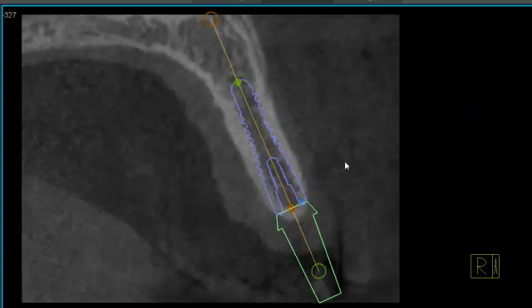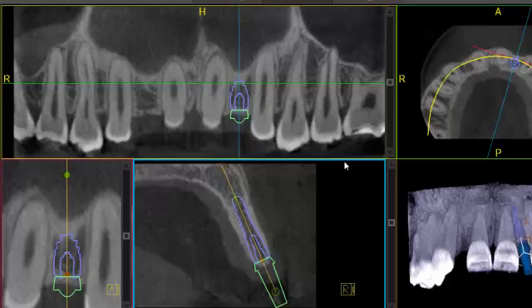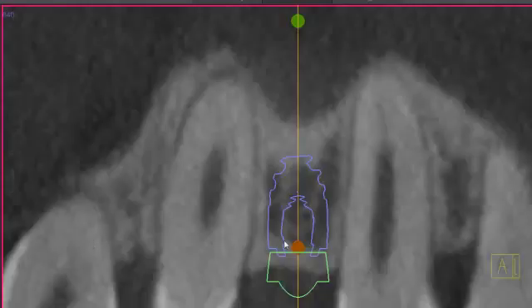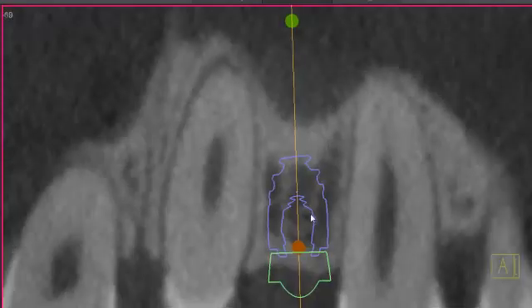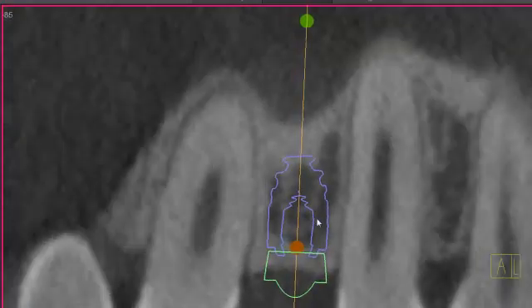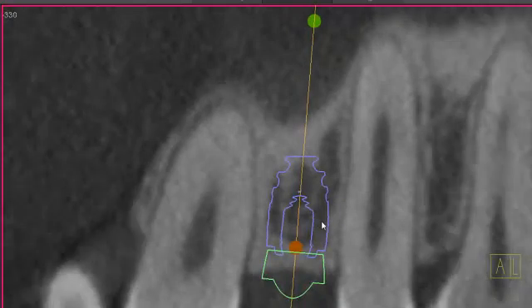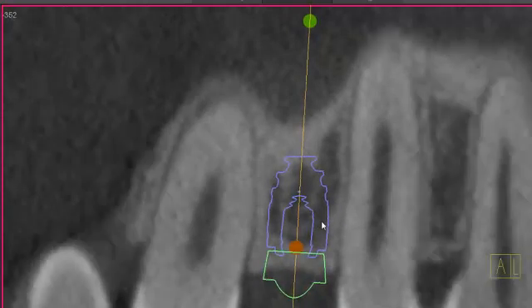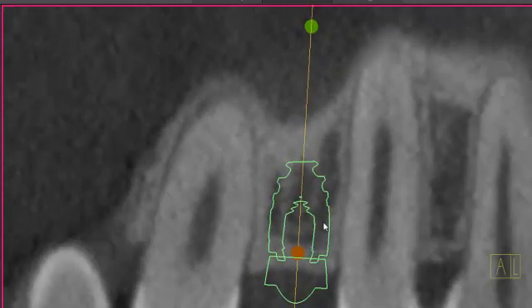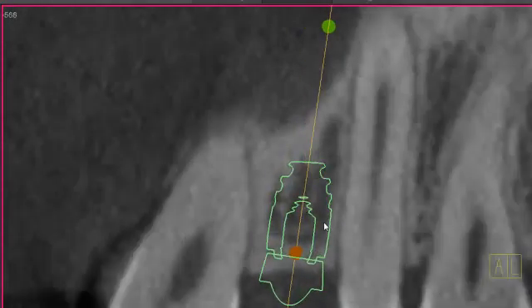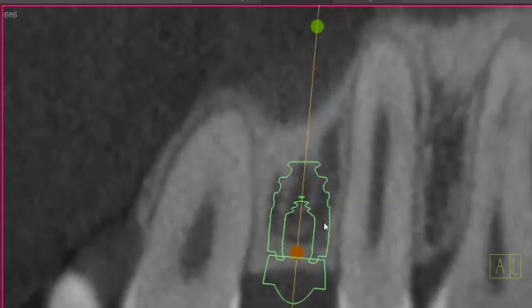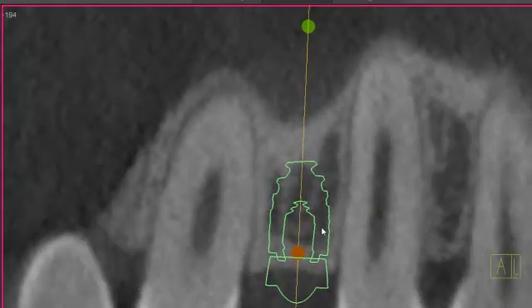Once you are finished here in the cross section, we can move over to our transaxial view. What this will allow us to do is roll around the implant as opposed to through it, and really allow you to check your mesiodistal spacing.